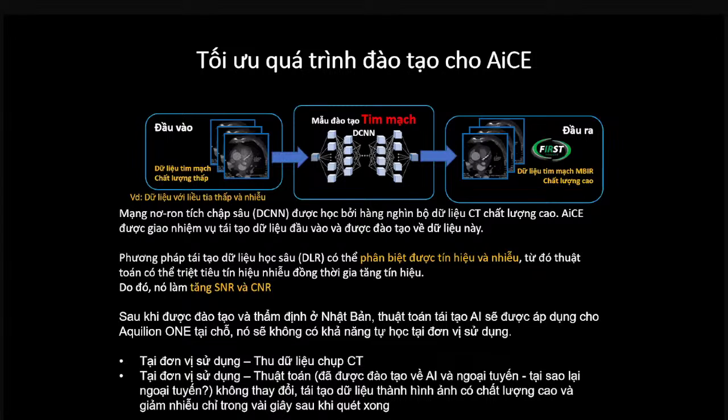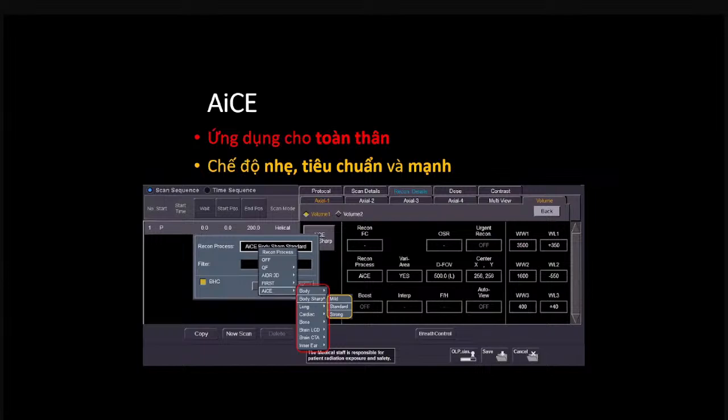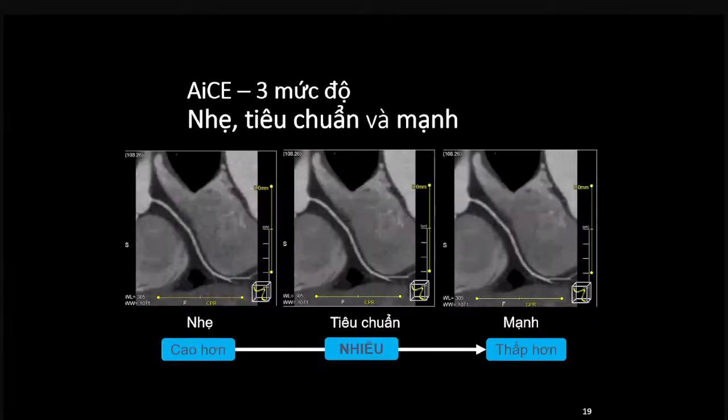This is to comply with American FDA approval requirements. So AiCE is available for all body parts. You can choose if you want mild, standard, or strong noise levels. For example, with cardiac, this is an example of mild noise. Mild means higher noise, standard, and strong means lower noise images.